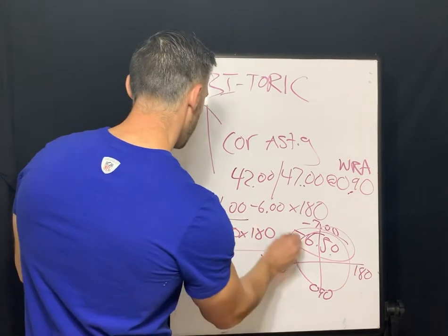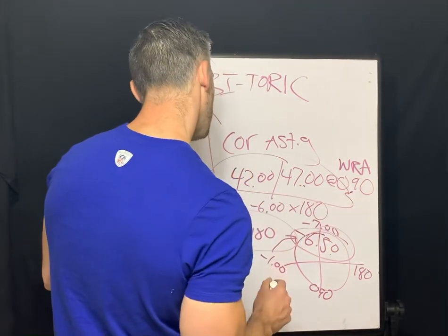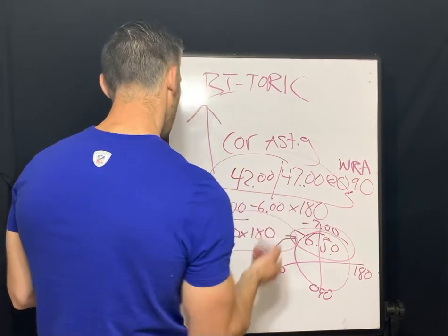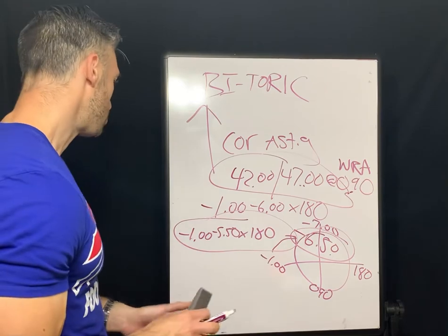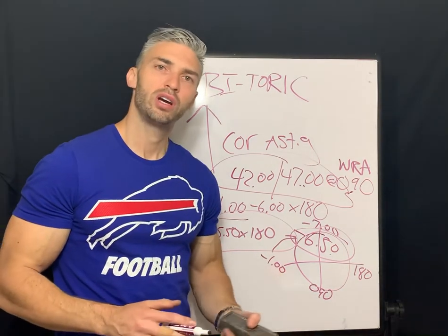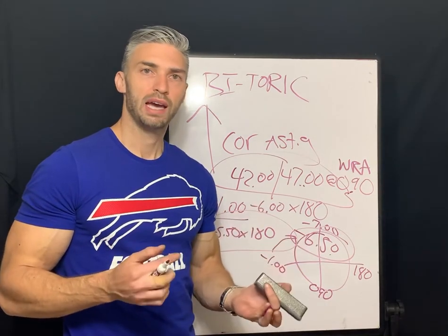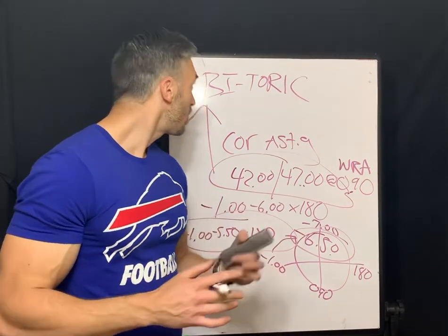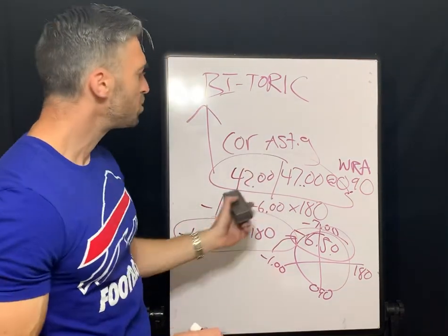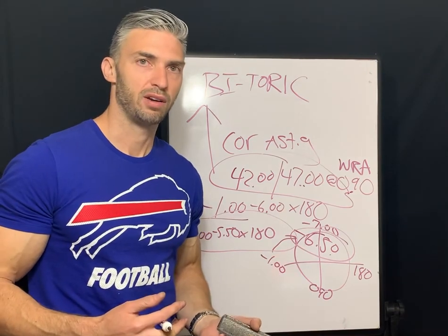So our new refraction, that's our K readings there. So again, we have, what, 5 diopters of corneal cylinder, 5.5 diopters of refractive cylinder. That's not that 2/3 ratio. So we're not going to just automatically go to back toric on that. So we're going to go ahead and select Bi-Toric for our answer, right? And also we know that's way too much astigmatism for a spherical gas permeable lens to take care of.